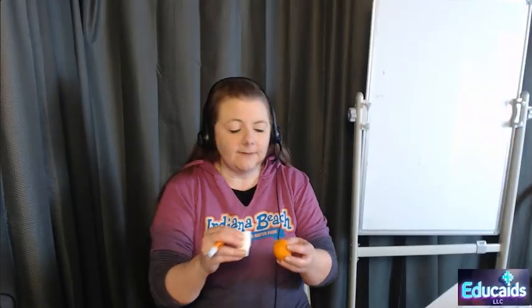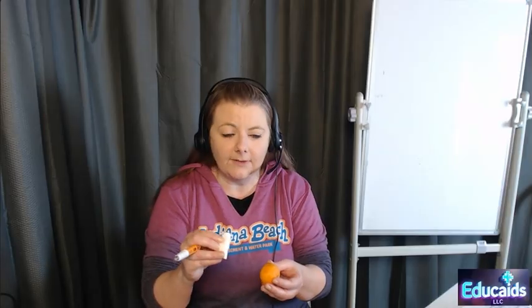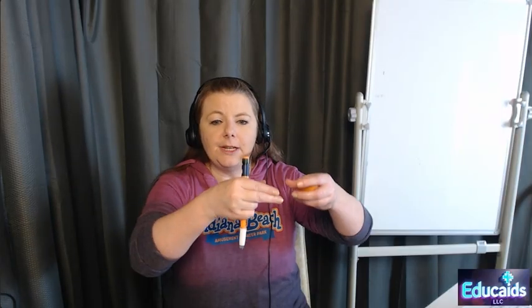They're going to check the order. We're going to talk about what the patient's blood sugar was. And we'll say that the patient's blood sugar was 205 today, and we're going to slide him with 5 units. So I'm going to pick my area, and I'm going to wipe it off with alcohol. These needles are so small, you don't have to pinch up a huge portion of the skin in order to give it.